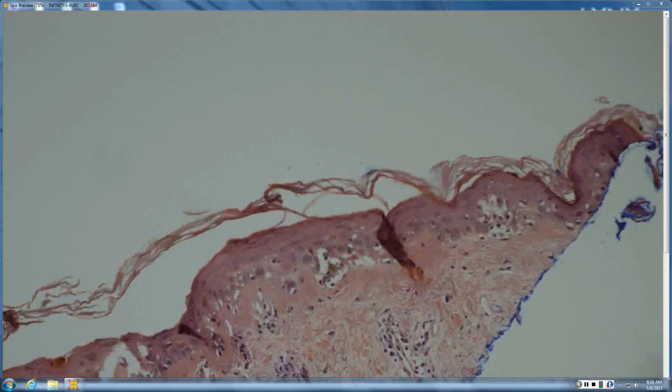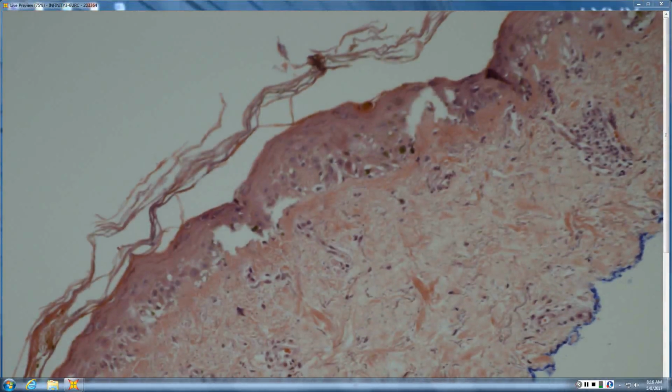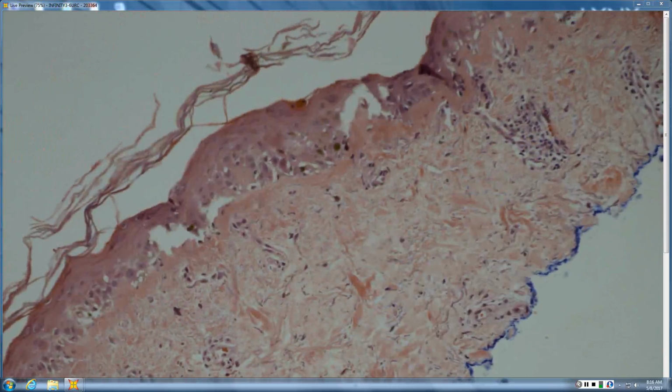That may be the acute change, which again is sort of an EM-TEN type change. This one has enough disorder, you might even think of GVH in it. And let's see if we can read that. Oh my. Yeah. With incidental neurofibroma.